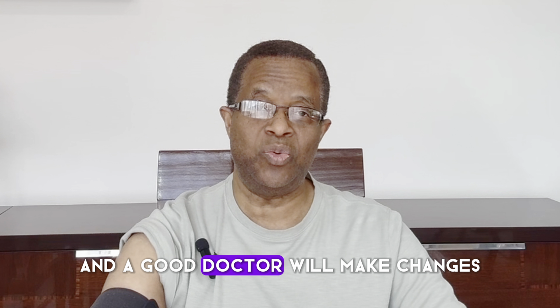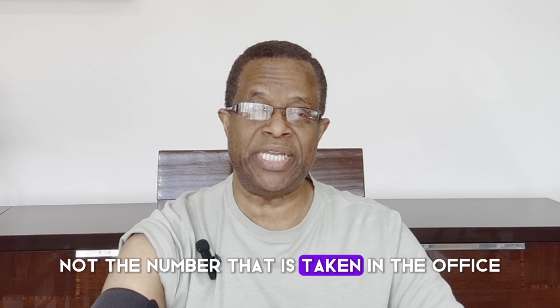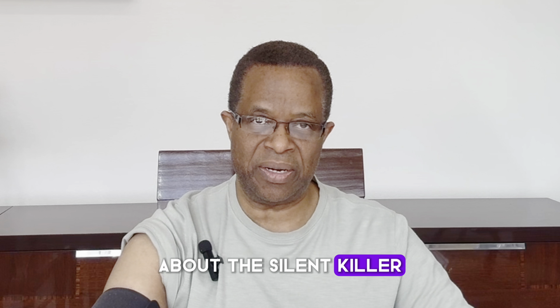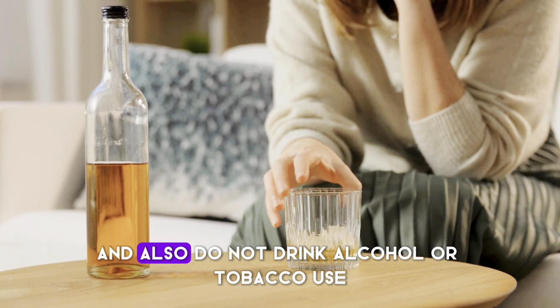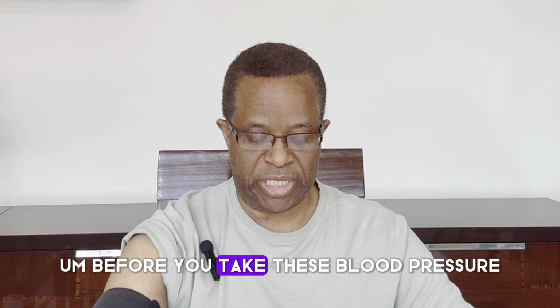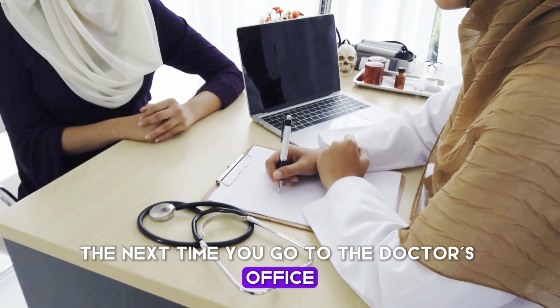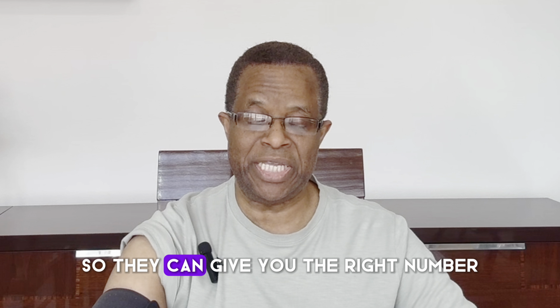And a good doctor will make changes based on the number you brought from home, not a number that is taken in the office. So these are some of the things that you should know about this silent killer, how to correctly measure your blood pressure. And also, do not drink alcohol or use tobacco before you take your blood pressure. So I hope this video is helpful to you. The next time you go to the doctor's office and they are taking your blood pressure wrongly, point it out to them so they can give you the right number.